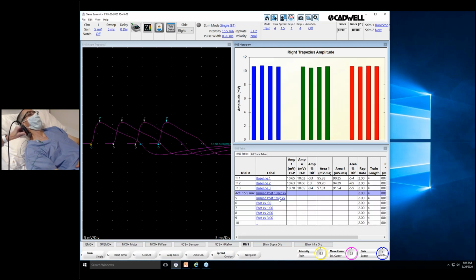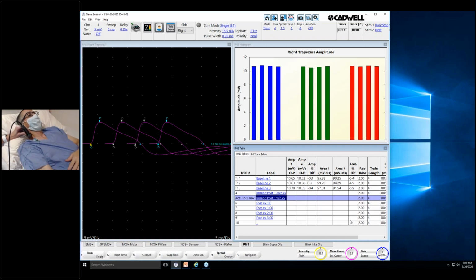Okay, so then I'm going to exercise, and I'm going to shrug my shoulder and just watch Jennifer's hand. She wants to try to make sure that stimulator stays on that nerve and is not sliding off. And it's hard to really exercise that muscle. You know, it's just a tough one. Yeah, you have to turn the volume up pretty high so you can hear the rumble of the muscle. Okay, I'm going to pretend that's a minute. Okay, here they come again.